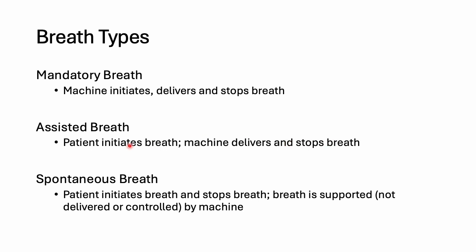Then the last one, the spontaneous breath, what you and I are doing. We initiate and we stop the breath. When we're talking about spontaneous breaths on a mechanical ventilator, we're talking about the person initiating and stopping the breath while on mechanical ventilation. In this case, the breath may be supported by the machine through pressure, and we'll talk about that in the second lecture. But it's not delivered or controlled by the machine. The person can determine when he wants to start and stop breathing. The inspiratory time can vary, the depth of the breath can also vary. That's a spontaneous breath.